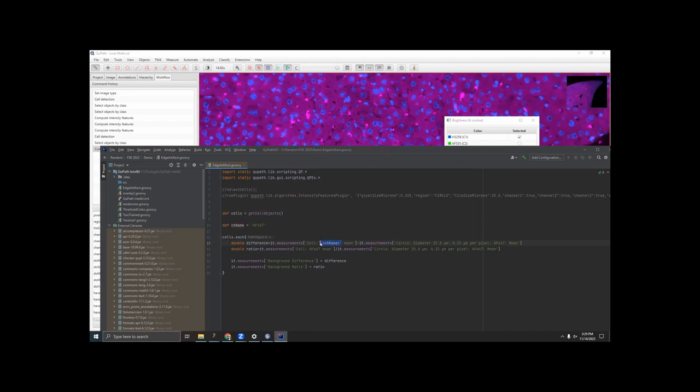So I'm going to copy paste this, and everywhere where I see 647, I'm going to replace it with plus channel name. I don't know why when I paste the quotation marks, it decides to try to escape them for me. I think it's trying to be helpful, but I don't super love that feature. And then in the measurement names, we also need to include which channel we're looking at. So I'm going to write that here.